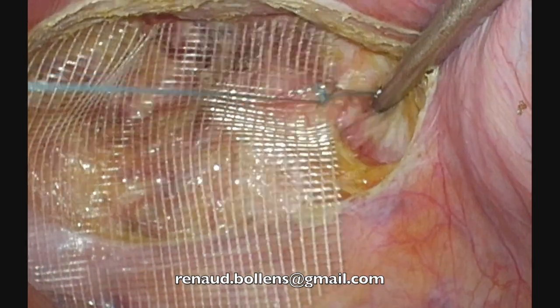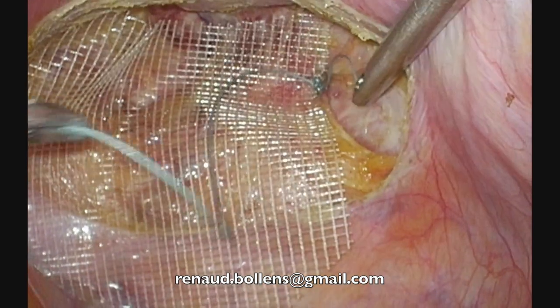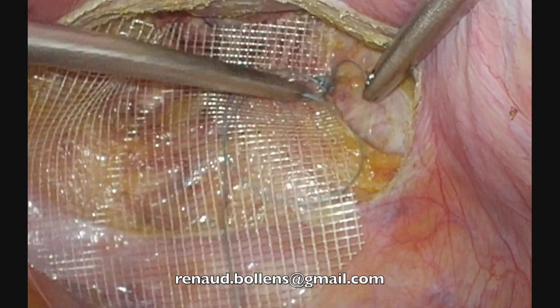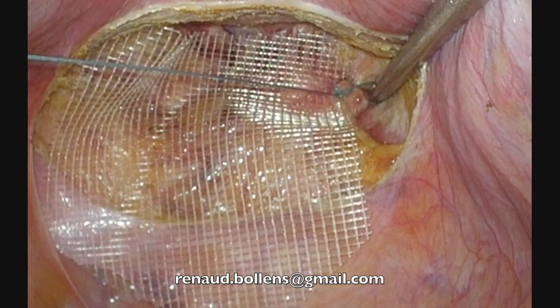Okay? To tighten is not like your shoes, not left and right, because if you pull left and right, you see that you put tension on the fixed point. The idea is to align the two needle drivers with the fixed point in the axis of the left needle driver. Then I push inside with the right one, and I pull with the left.